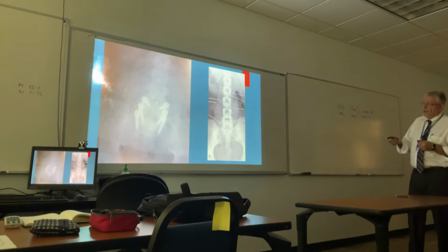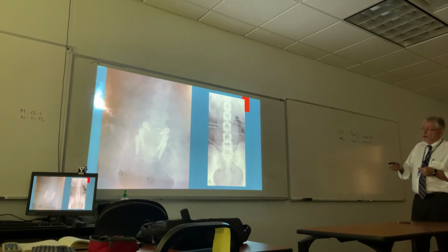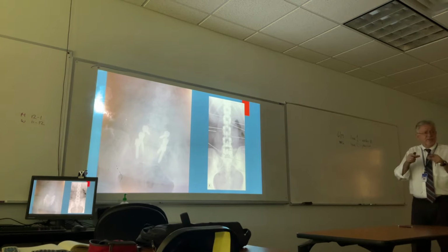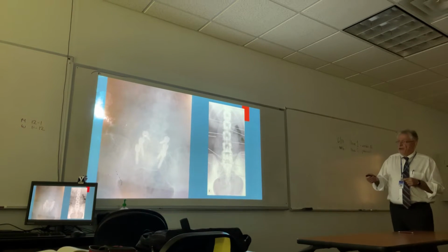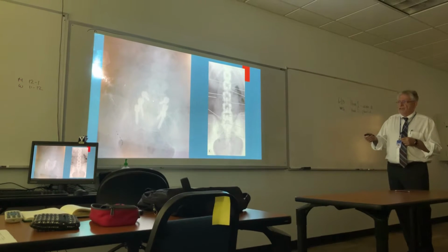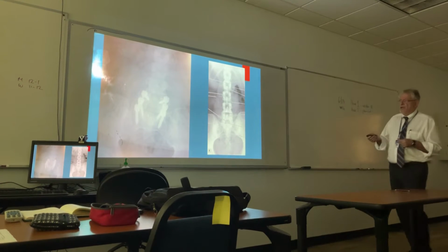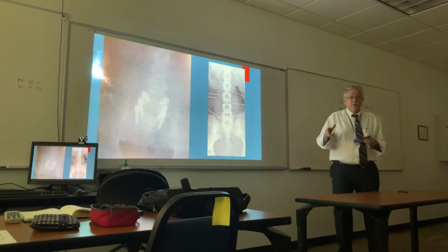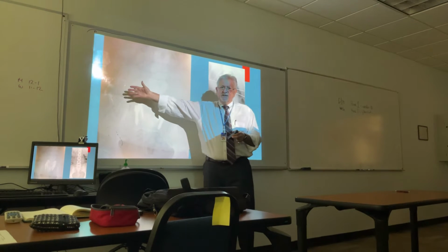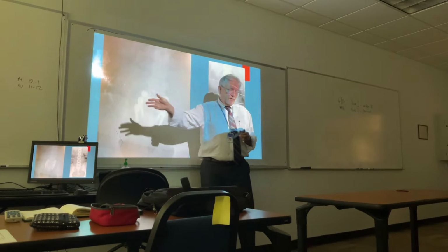Spinous processes. So they did either a laminectomy first, okay, and then a wider laminectomy, you get access to the disc, okay. I don't have the lateral, but usually if you see surgical intervention, that's to hold the disc in place, okay. So my argument is, you know they had surgery, you see the scar, all right? You can't use this as a contact point when you're doing your flexion distraction. There's no spinous process, it's been removed. Right. Not every surgical intervention of the lumbar spine takes the spinous processes out, okay? But on the lateral, in this case, there shouldn't be any spinous processes at these particular levels, right, okay?